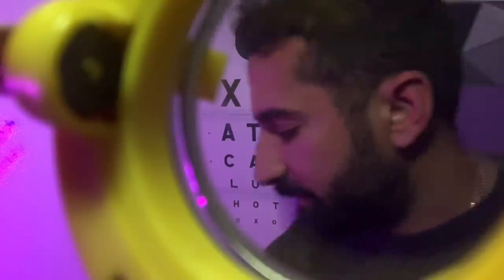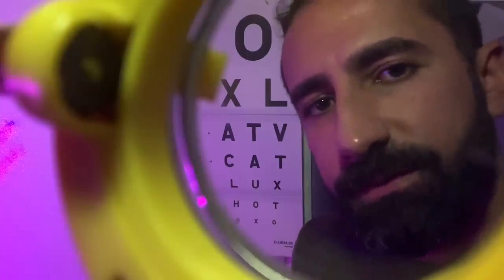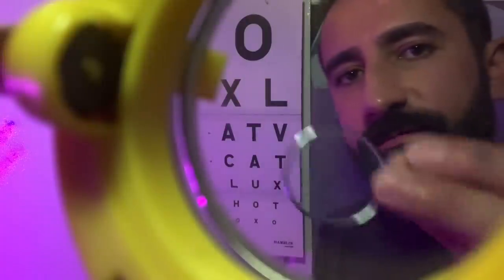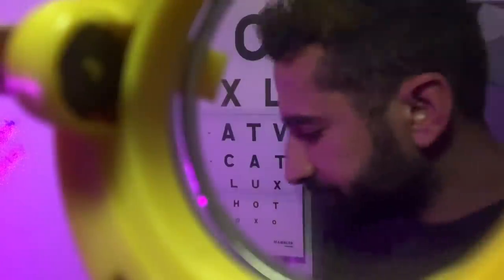Excellent. Now, I'm going to ask you to look at the N5 print. I'll show you some more lenses and you tell me if the print is clearer with or without. So I just have a small plus 0.50 diopter sphere here. Okay, looking at N5, is it clearer with the lens or without? With or without or about the same? With or without? Excellent.